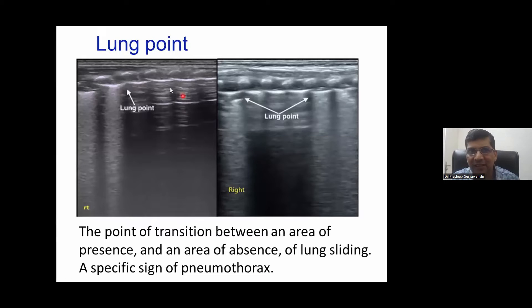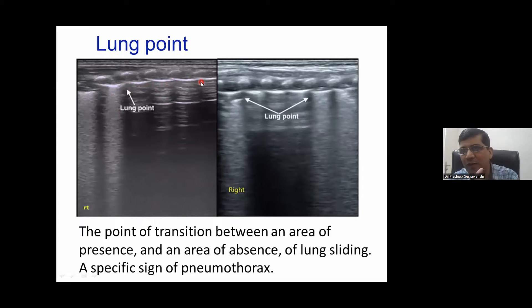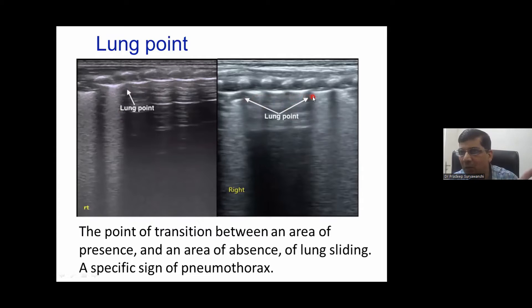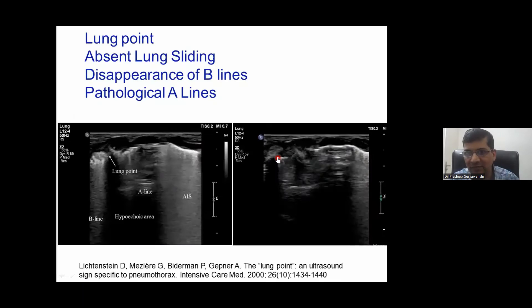Let's recapture. This is the patient — these are the A-lines, these are the B-lines, and this is the lung point, because lung sliding is absent here. I'll show you the video as well. Here you can see: B-line, B-line, A-line, and this is a pathological A-line — and this is the lung point.